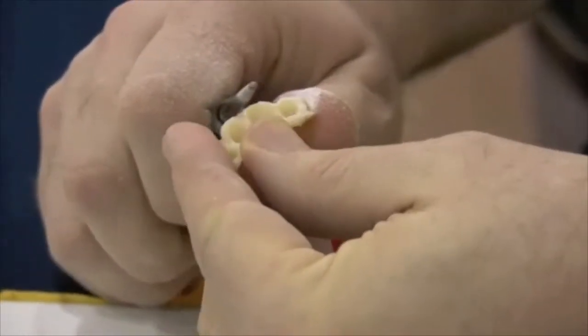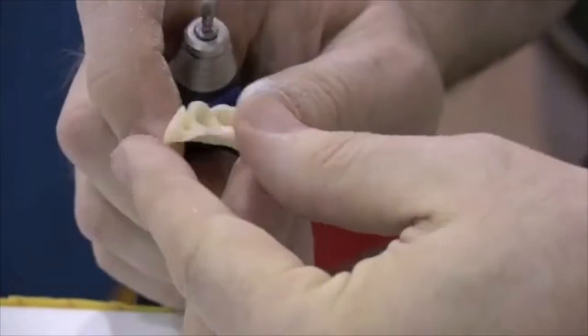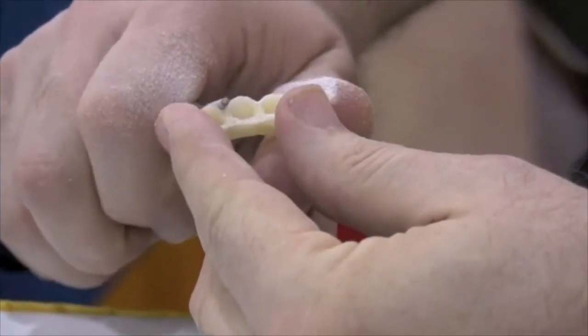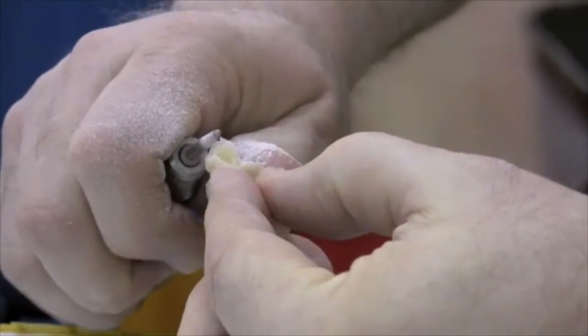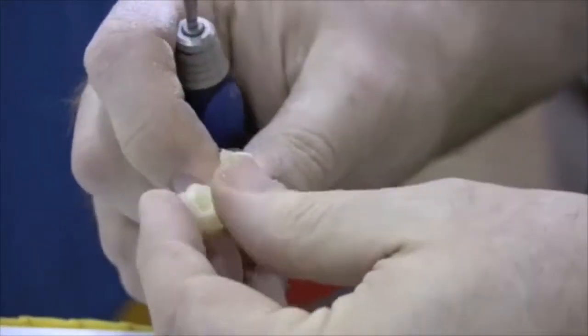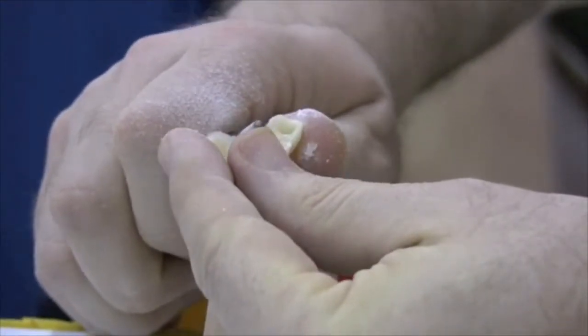I'm using my magnification so I can get very close and precise with the marginal fit. Keep in mind too, if I make a little mistake or carve a little bit too much away from the margin, I can use the add-on material to edit that or correct that.